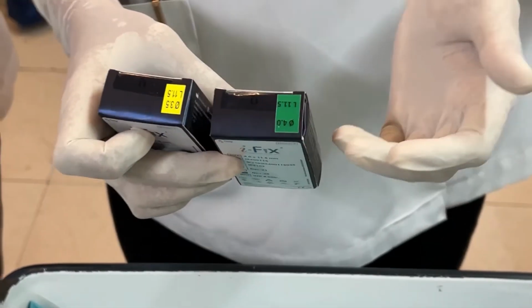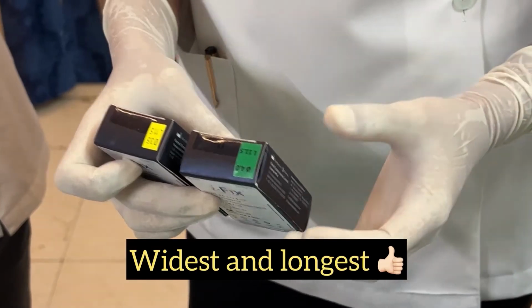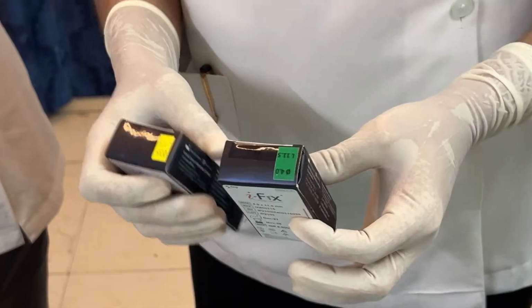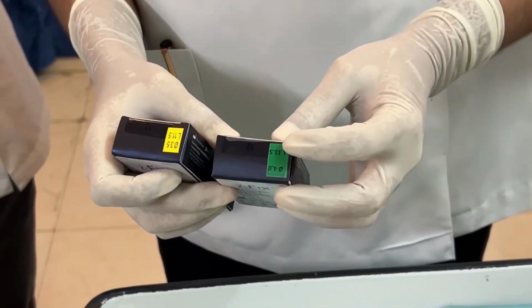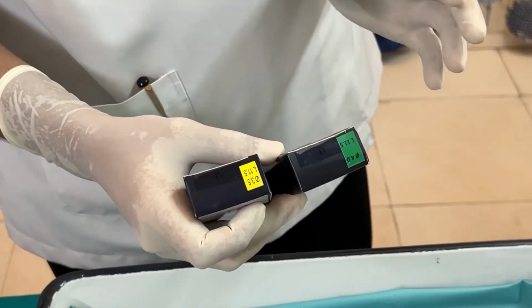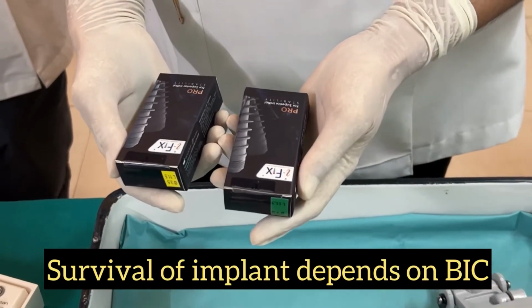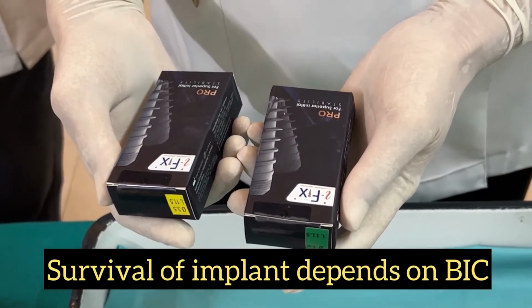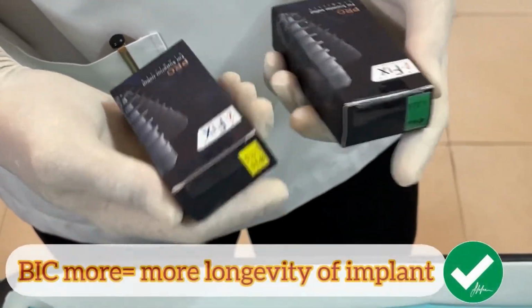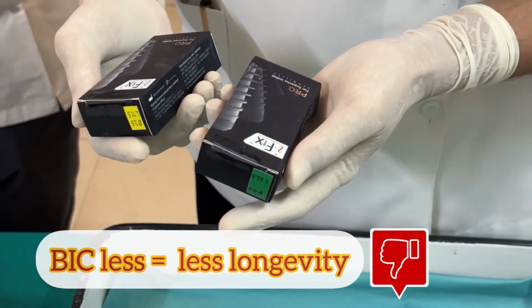So accordingly, based on available bone and the tooth which you are replacing, we try to place the widest and the longest possible implant. Whenever we have to make a choice between width and length, a common misconception is going for the longer implant. No, that is wrong. Please understand, ultimately the survival of your implant is dependent on something known as BIC, bone implant contact. If BIC is more, the longevity of the implant is more. If BIC is less, the longevity or the life of your implant is less.